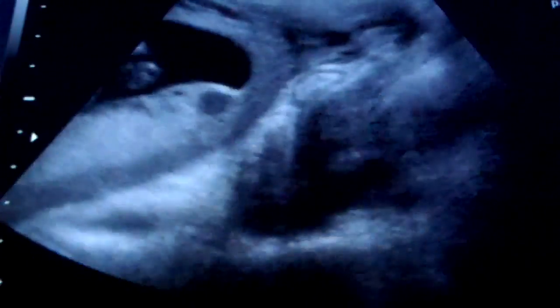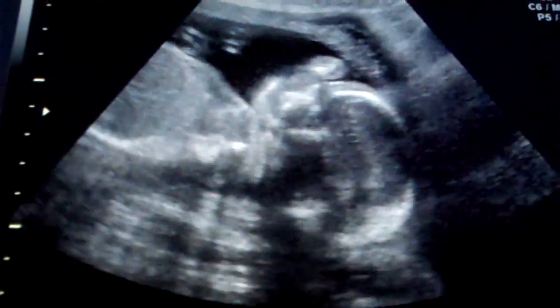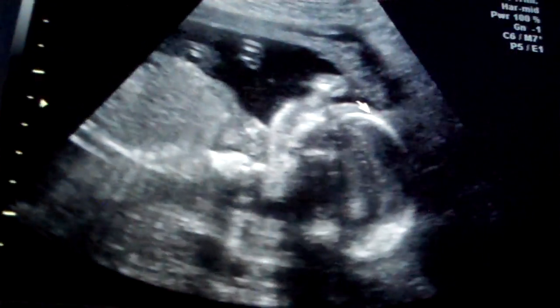Hopefully she'll get her head down here in a minute. Just about make out a profile. This is her forehead, her nose, her lips, and her chin. She's got that arm right there in front of her face. She looks like something. She's a cuddler.